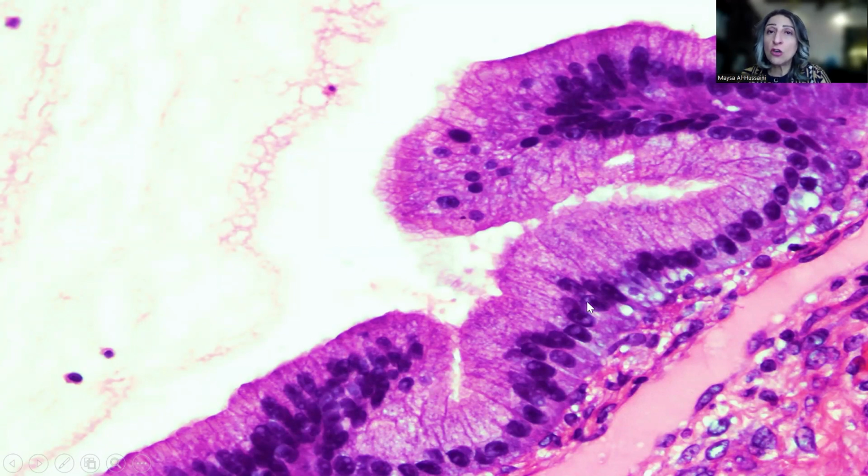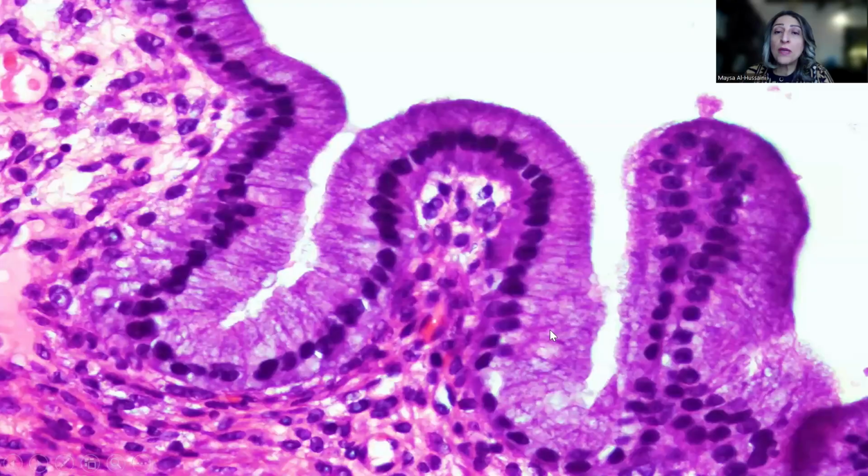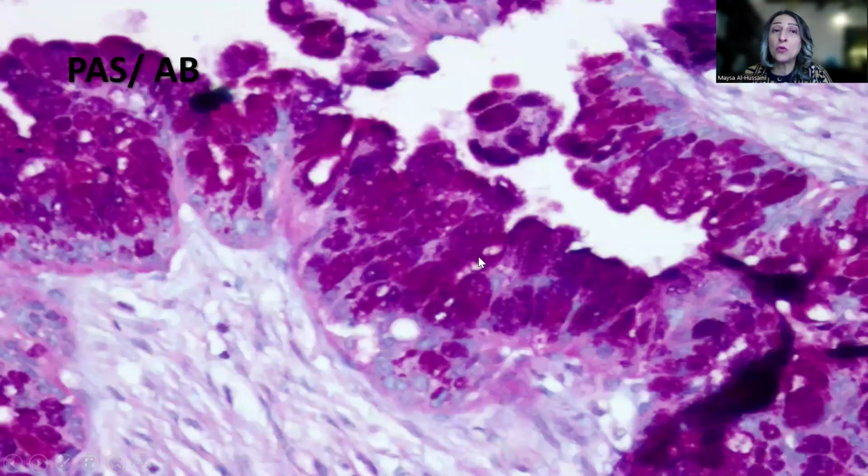saw with the cervical adenocarcinoma, perhaps not the very well differentiated component, rather the component with the slightly enlarged nuclei and prominent nucleoli, and again here basally located nuclei with the voluminous amount of the cytoplasm and with the prominent nucleoli. And please note also that it is still lacking the mitosis and the apoptosis.